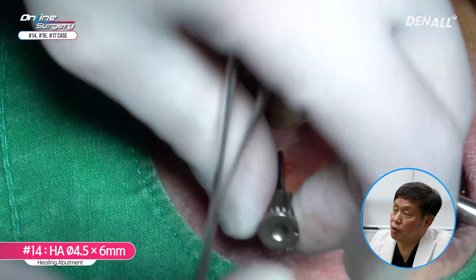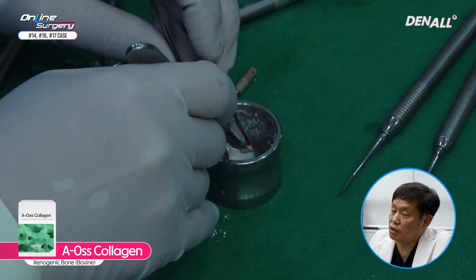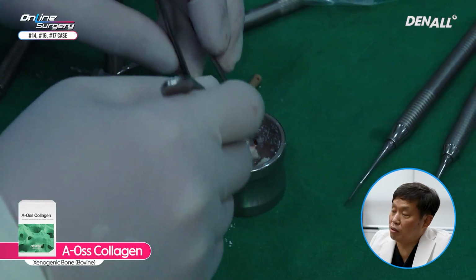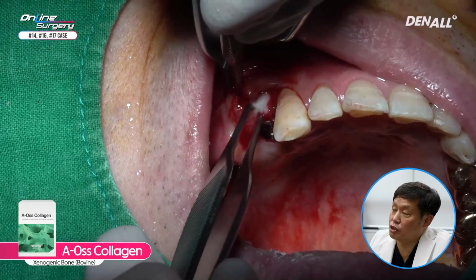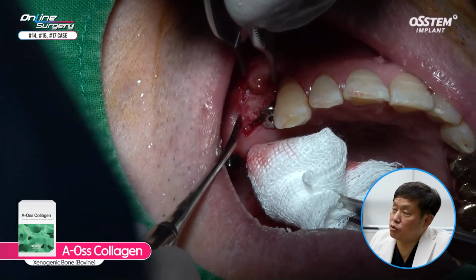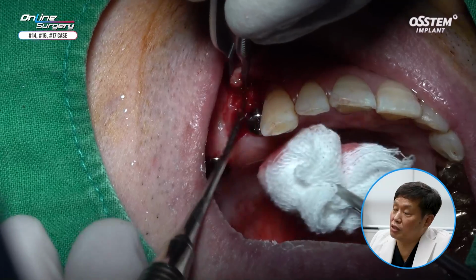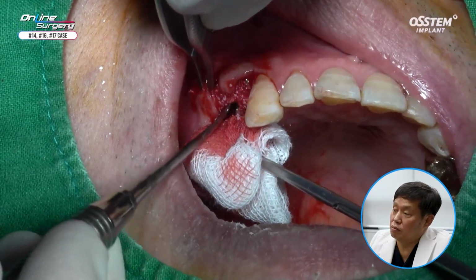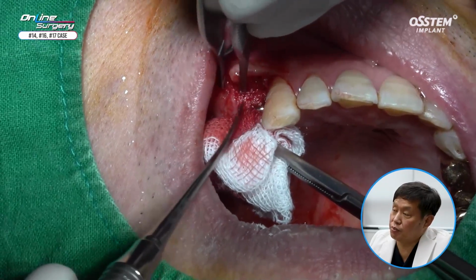In the buccal bone defect area, AOS collagen was used. Rather than using particulated bone graft material, if you use collagen material, it's easier to apply, and even without the use of membrane, healing can be done nicely. If you use AOS collagen, you can do socket preservation or GBR in the case of buccal bone defect easily. AOS collagen was used to do bone graft in the buccal side because minor flap reflection was done. Membrane was not used.